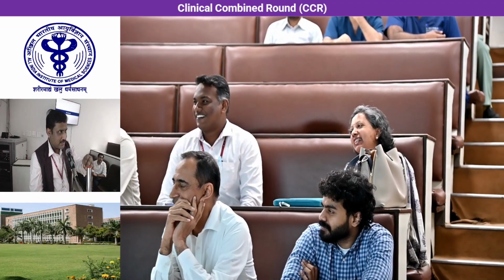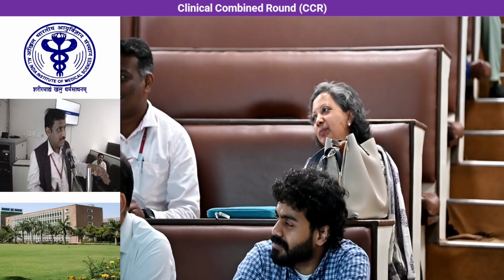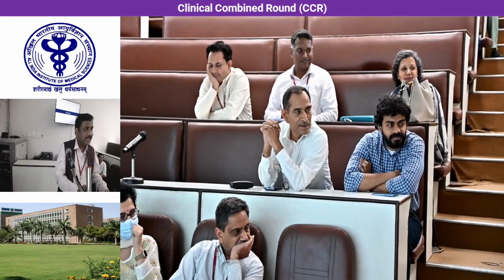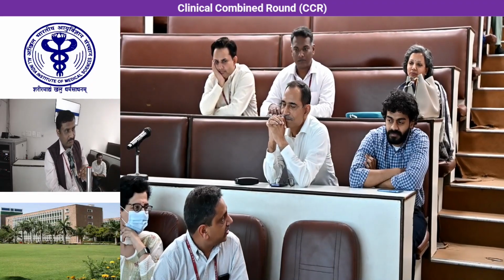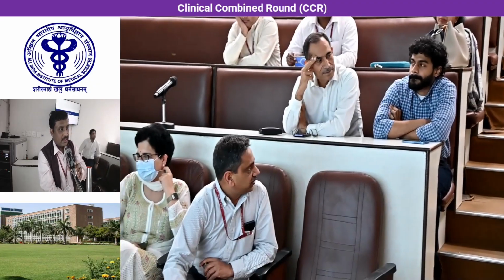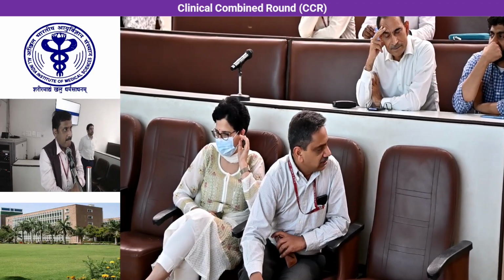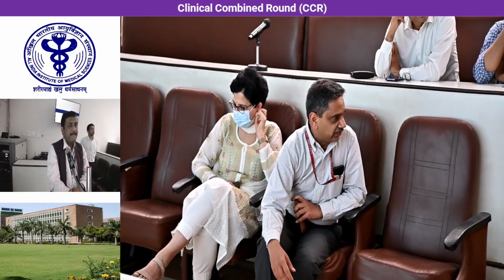In this case, because this was infrahepatic and it was a right-sided tumor, and the tumor was not very bulky, the tumor was confined to the kidney. So it was too easy to start with. Level 2. We could have saved a couple of liters possibly if we had clipped the lumbar vein. Yes, we did not realize that. It was easy, we could have done it very easily. It just didn't strike us that that was also possible. But we could have saved a liter and a half.